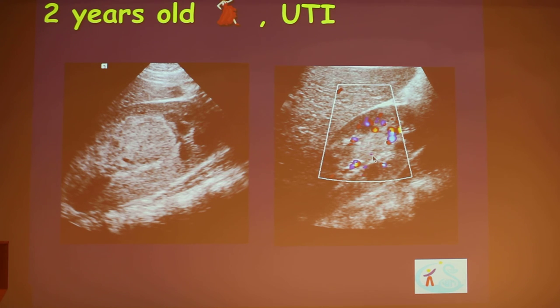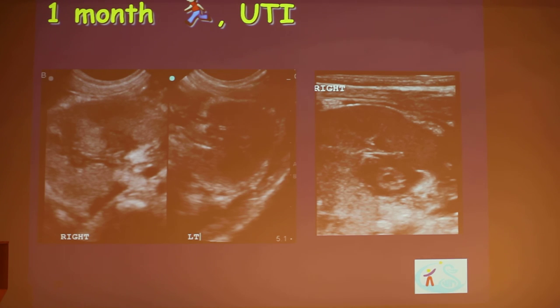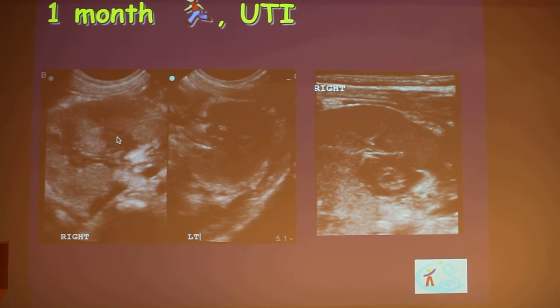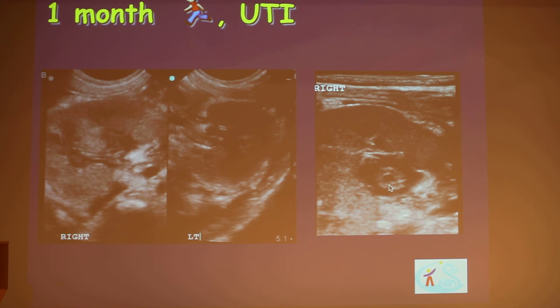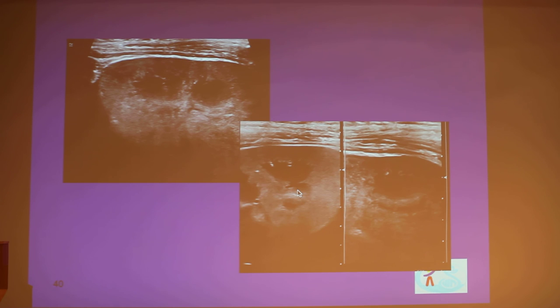With color Doppler, the area was avascular, and two weeks later the same avascular lesion was much smaller — confirming focal lobar nephronitis. Using a higher-resolution linear transducer — what we call AHARA, as high as reasonably achievable — comparing the right and left kidney in a baby with UTI, you can see increased echogenicity and uroepithelial thickening as signs of infection. Multiple interfaces caused by parenchymal edema are also visible on the abnormal kidney.